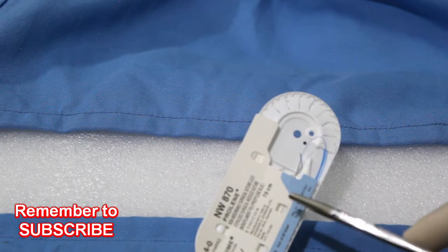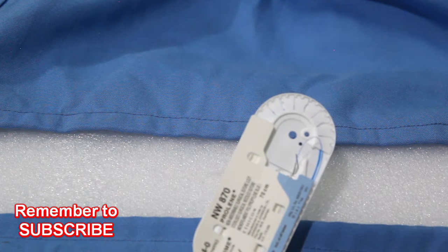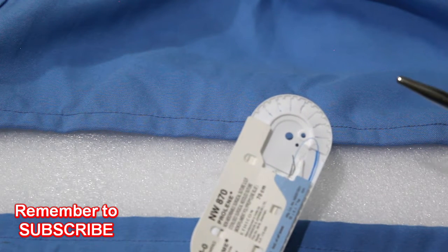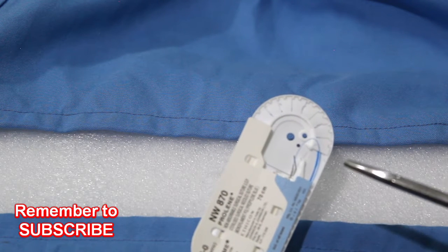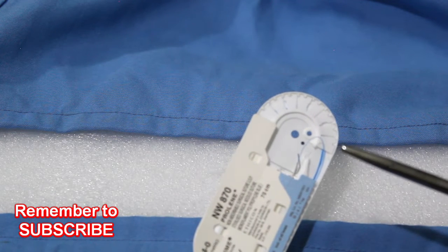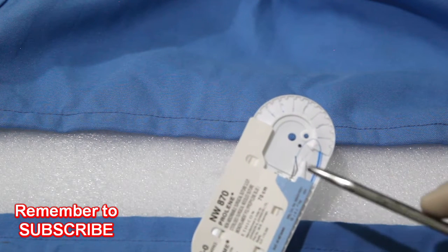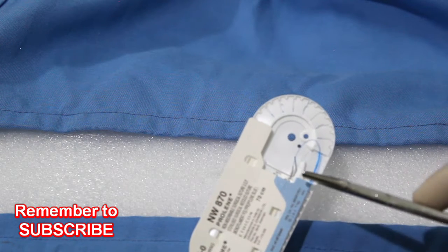For suturing we need a suture material. This is 4-0 prolene, a commonly used suture material — polypropylene prolene. It is a synthetic non-absorbable monofilament suture material; it is actually a polymer of propylene. It is used in all general surgery, plastic surgery, cardiovascular surgery, and also for skin closures.